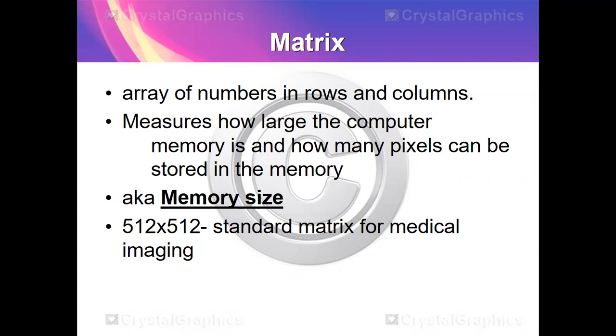So this is the coverage of our final exam for CT scan. We will start with the important terms that are used in the CT scan department. The first term is matrix.